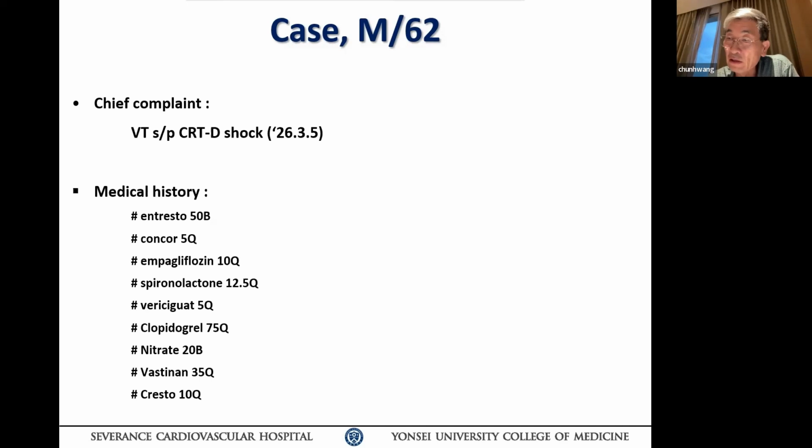So I think I fully agree that if you can get the MRI, if possible, I don't know, CRTD device is compatible or not. So I think we can optimize the ICD timing, look at the QRS complex, optimize the heart failure, get the substrate evaluation of the MRI if possible. Then maybe try to ablate. And that may be something that you rather put an amiodarone. That one option. But on the other hand, if it's a mixed cardiomyopathy, outcomes are not going to be good. Very long procedure, patient likely getting complication. So that would be against that. So I think it's going to need a little bit of clinical judgment here.